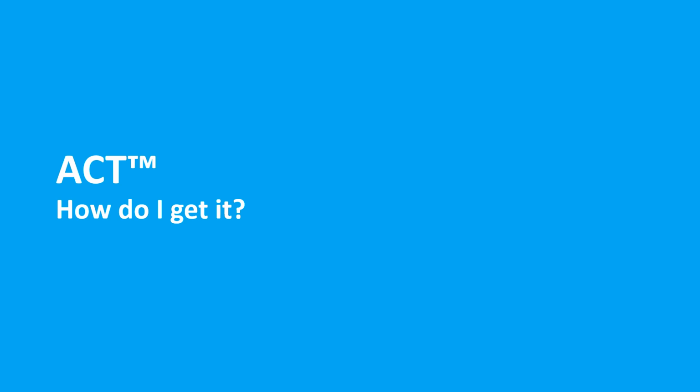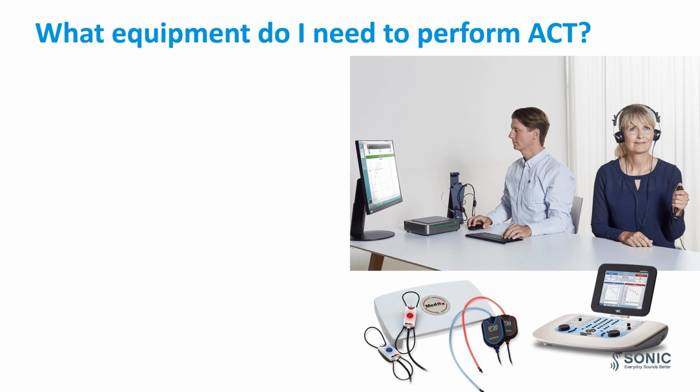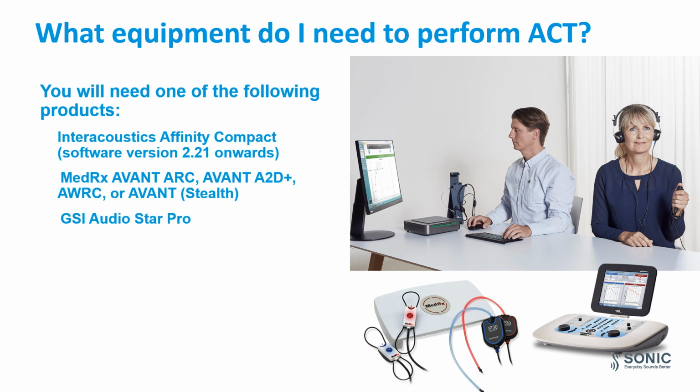Now that we know the possibilities with this test, how do you get it? In order to perform the ACT test, you will need to have the relevant licensed software and diagnostic equipment. You will need one of the following products. From Interacoustics, it is available in Affinity Compact software version 2.21 onwards, as shown on the picture at the top.